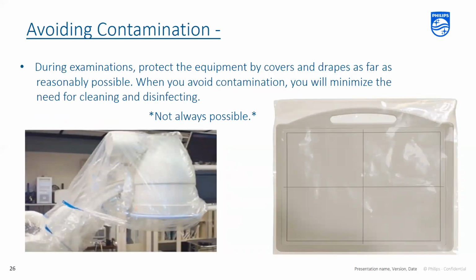Try to avoid contamination if at all possible. We know it's not always possible. During examinations, protect the equipment by covers and drapes as far as reasonably possible. You will minimize the need for cleaning and disinfecting.